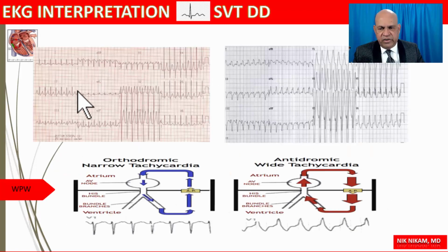All right, here are two examples put together. The narrow QRS tachycardia, where the impulse is going through the normal AV nodal tissue, which can be slowed using ABCD drugs that slow the AV conduction, whereas here the treatment of choice would be IV or oral procainamide.